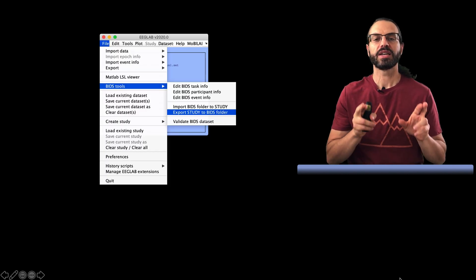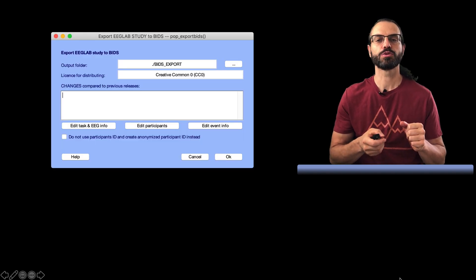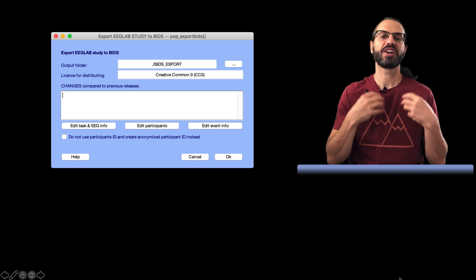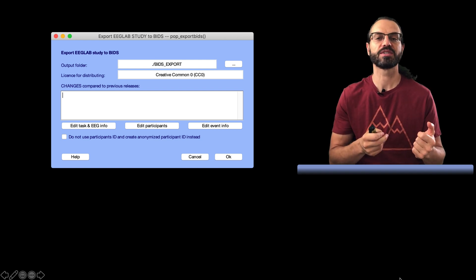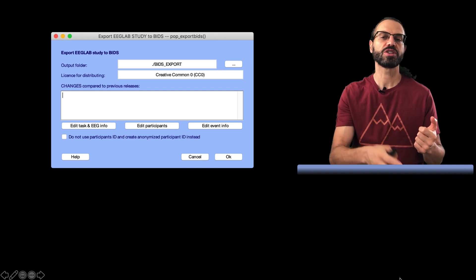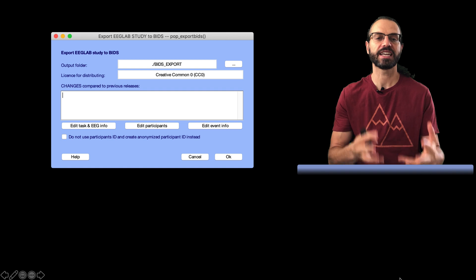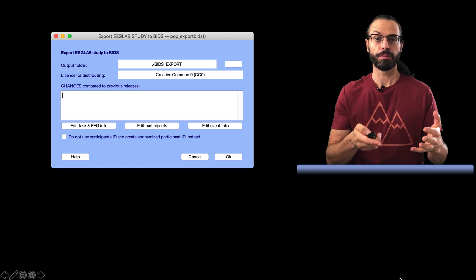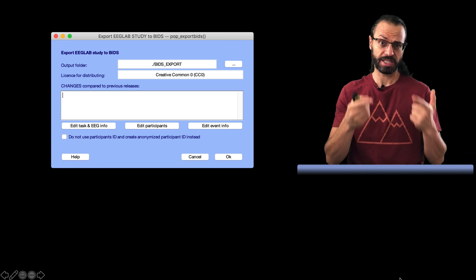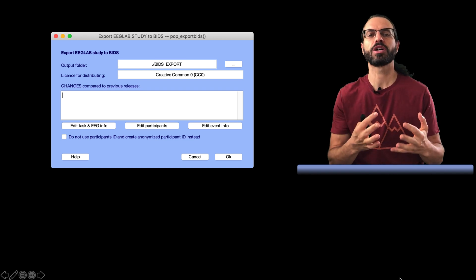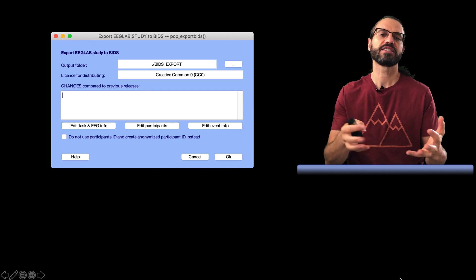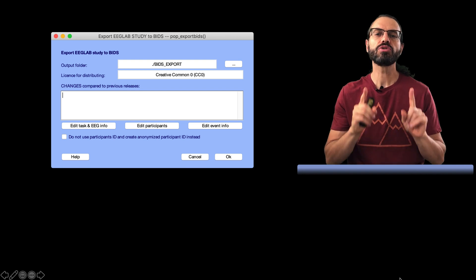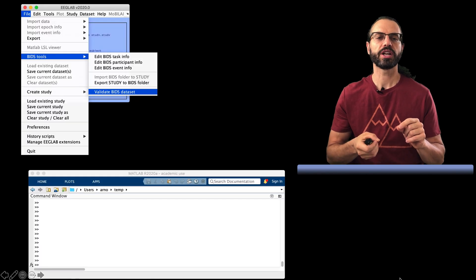We select the Export menu in the BIDS submenu. Here it is asking us where we want to save the exported data, the type of license we want to use, and the last changes since the last published export. For example, you might have exported the first time and published your data, but some information was missing, so you're now exporting the BIDS dataset a second time. You can leave that empty. You also have the option to click on buttons to review or edit the task information and event information. Finally, if you have not anonymized your subject ID, for example, if you use subject initials for their ID, which is bad practice but sometimes happens, you can check this box to generate new anonymized IDs. So you press OK and your data has been exported.